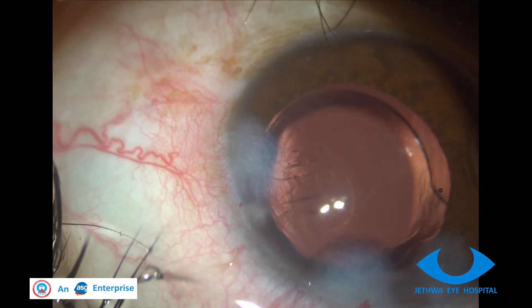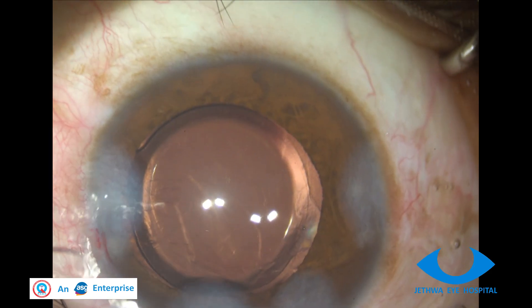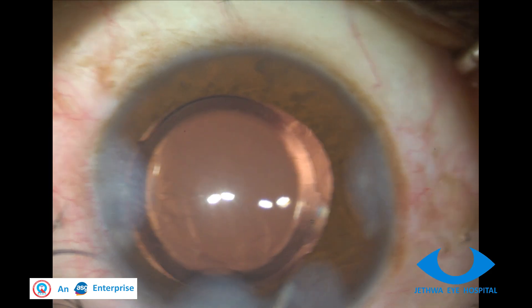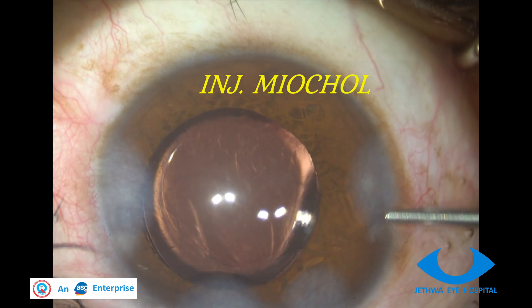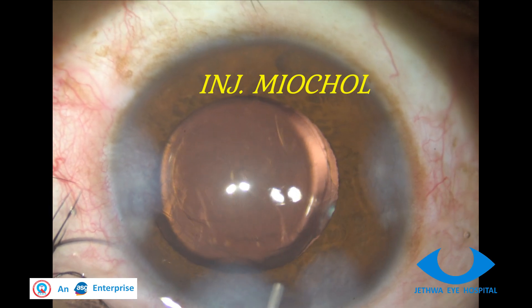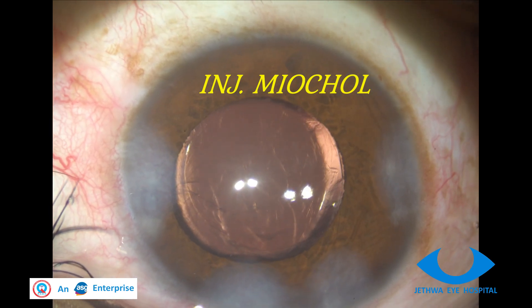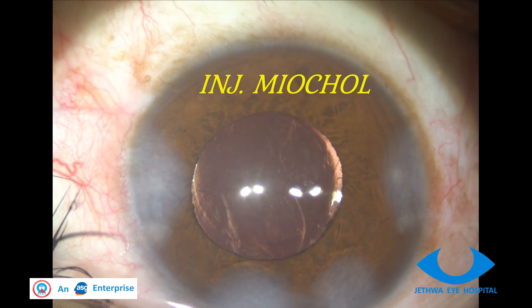Good wound hydration is done to prevent leakage, and injection Miochol is injected to make the pupil as small as possible. It can be attempted from multiple ports so that different areas of the iris are contracted.